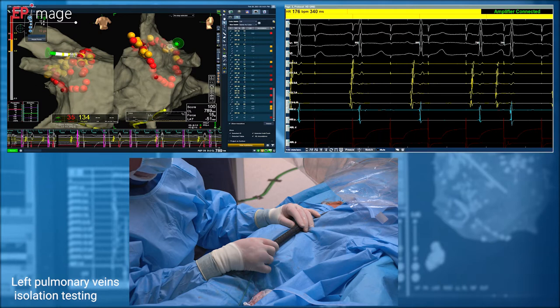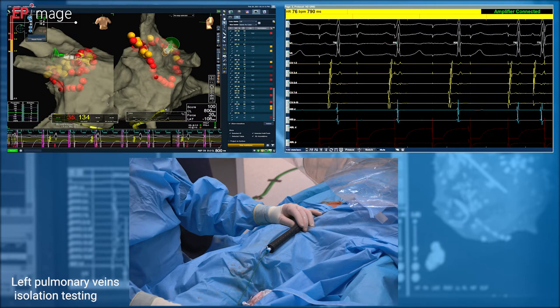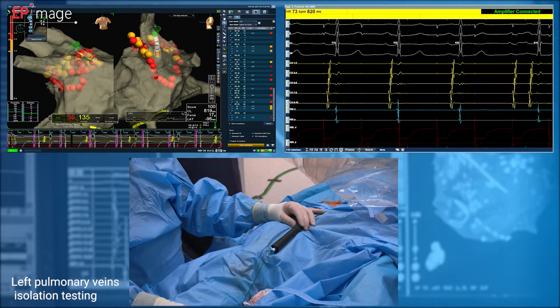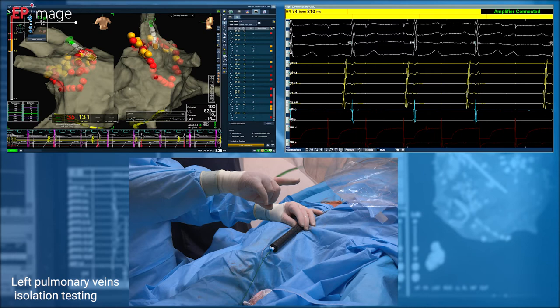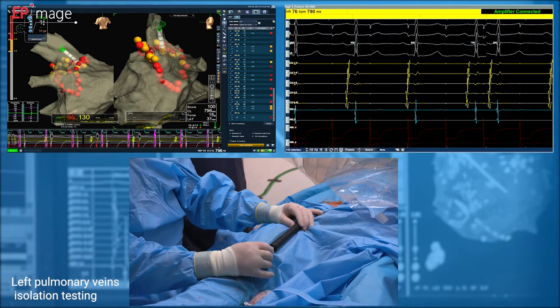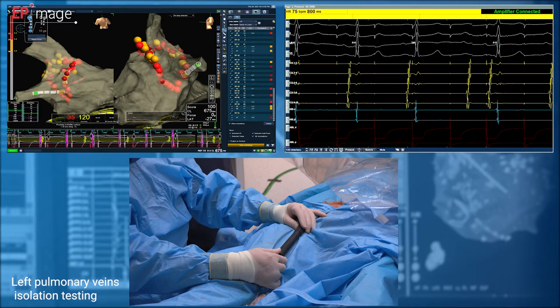After performing the line around pulmonary veins, we are checking for effectiveness of this line, for any leaks, any gaps. So I usually do, as you can see, I'm just behind the line, not too deep inside the veins, but trying to be behind the ablation line, but still to keep the catheter in the vein, in its antrum. I'm pacing with a current between 10 and 15 milliamps, but still keeping my eye on the contact. So you always have to observe if your pacing catheter has good contact with tissue.